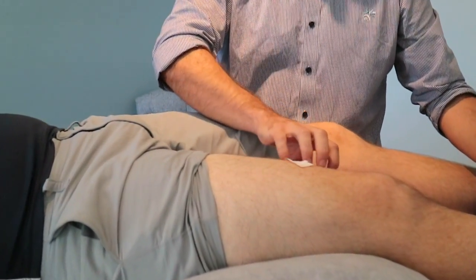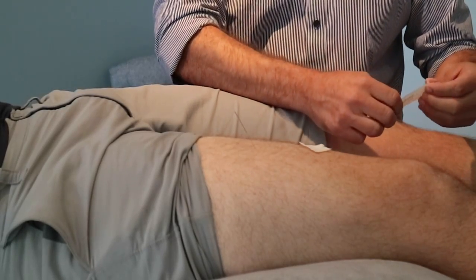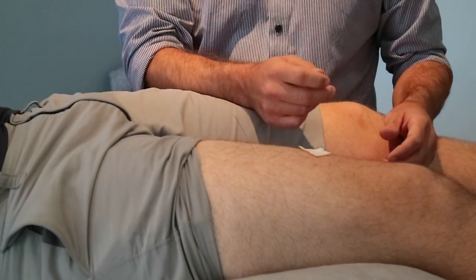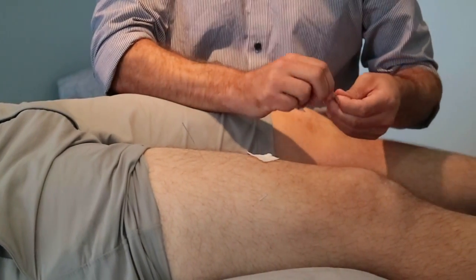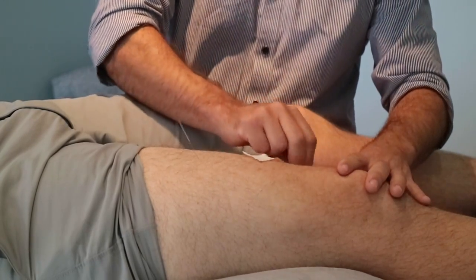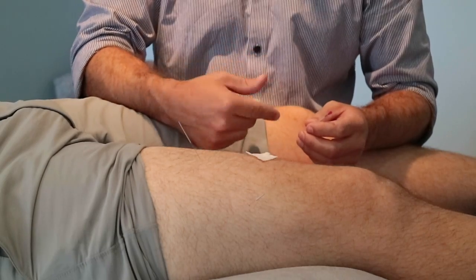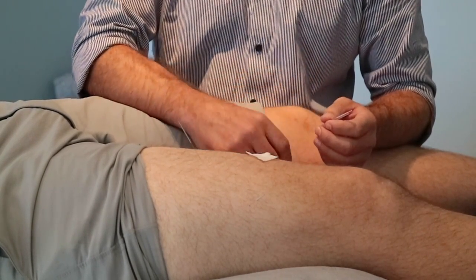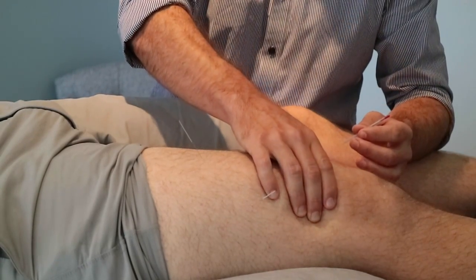Now for the vastus medialis and the VMO, we can actually use a slightly smaller needle. So we're going to the 40 mils, because the trigger points are a little bit more superficial on those, depending, of course, on the amount of adipose tissue covering. So we're going to be coming across to the vastus medialis. This one is fantastic for activating trigger points and trying to get the vastus medialis woken up, to get the firing mechanisms working. We just pop in, it's really, really obvious.